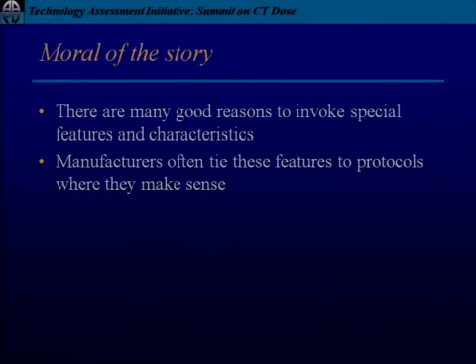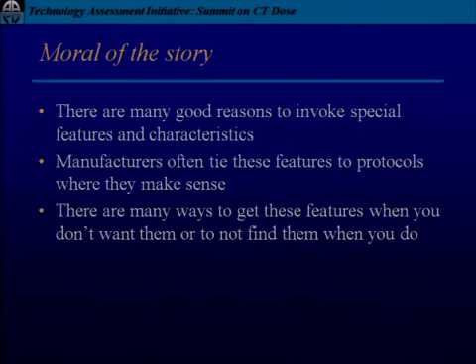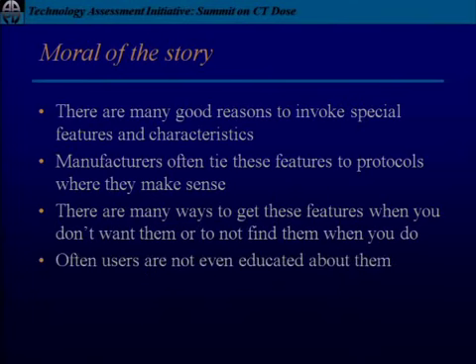But if you try to go away from some of their suggested defaults, you can walk yourself into an area where you're on a little bit of thin ice unless you have the data of all those performance characteristics in front of you. So there are a lot of ways to get the features when you don't want them, or sometimes when you do want them, to try to find them.